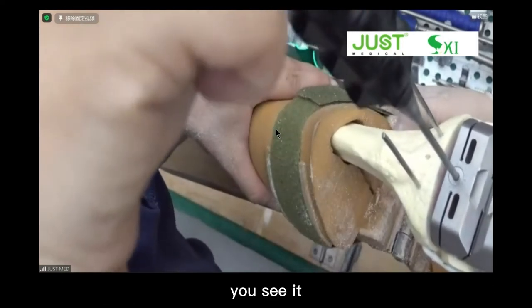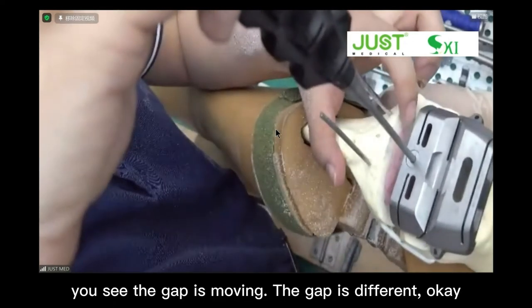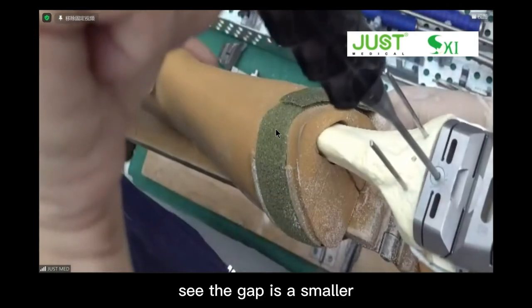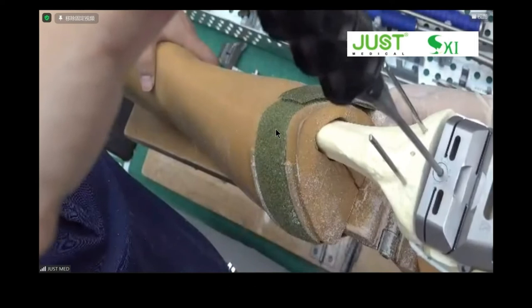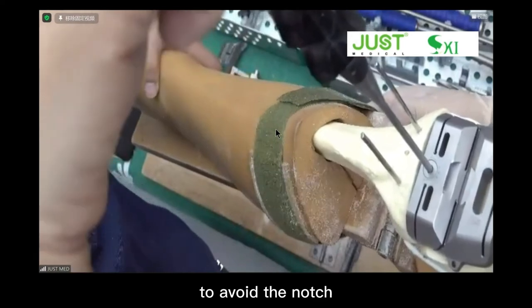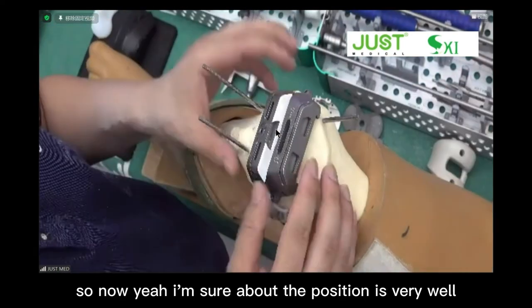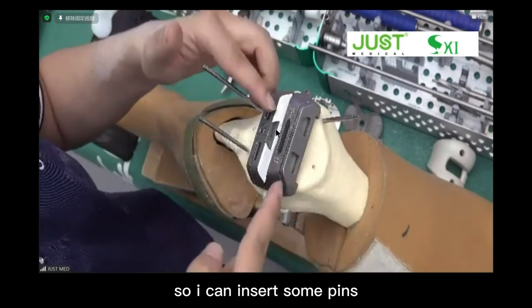You see it? When you turn it, you see the gap is moving. The gap is different: when you turn it, the gap is smaller, or the gap is larger. You can see that. In this way, we can move the cutting block anteriorly to avoid the notch. So now I'm sure the position is very good, so I can insert some pins.